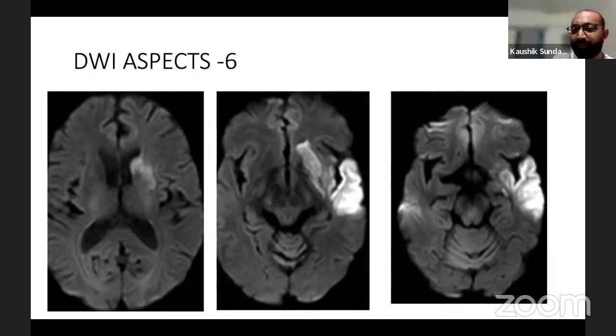See, even the diffusion restriction is different between the subcortical and the cortical areas. Yes. Okay. So this gives you indirect evidence that this is chronic. Meaning, I'm not saying that this is a chronic occlusion. Please understand this. What I'm trying to tell you is there is some chronic vascular insult that is happening to the left side of the brain, which the patient is maintaining over time. Okay. That is what it is telling you, right? So this is my first thought that I am thinking of.